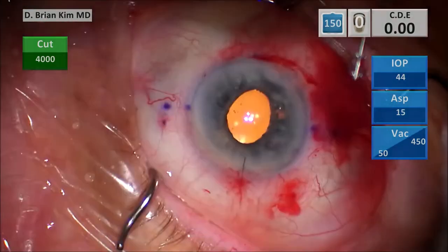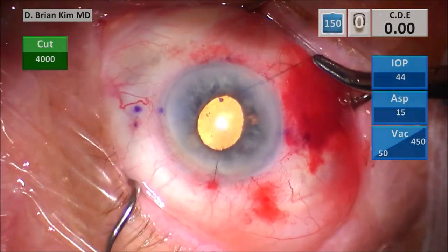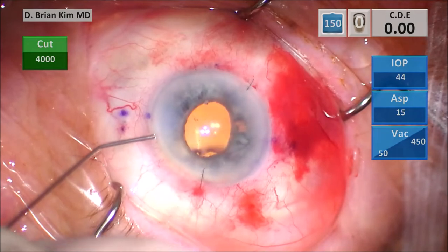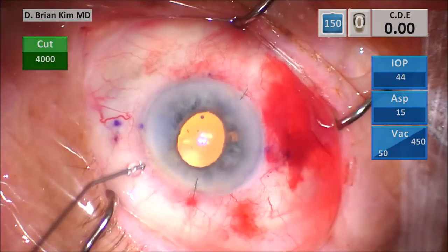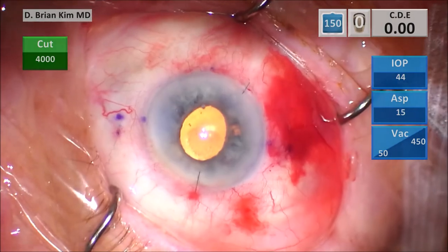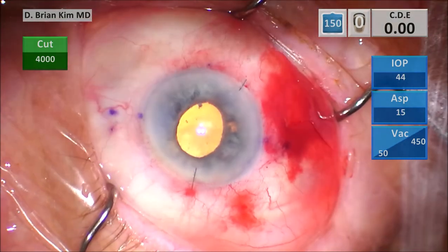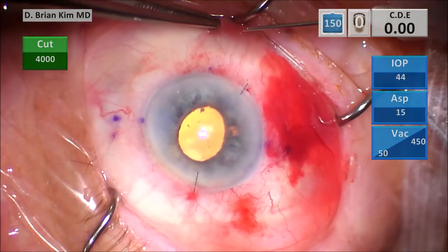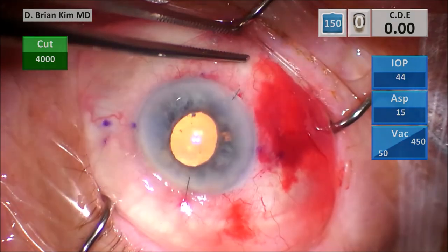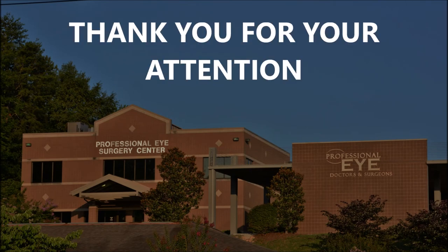I was doing the Seidel test and noticed that the AC maintainer incision was leaky, so I had to place a suture there. You don't want to hesitate to put sutures in, because a leaky wound can cause vitreous to come out — it's just not worth that risk. Now I have really nice watertight incisions, a nice round pupil, no evidence of vitreous in the anterior chamber, with a perfectly centered Sensar lens with scleral fixation. At the end I inject some lidocaine, then Kenalog as well as some antibiotics. I hope this was helpful, and I thank you for your attention.